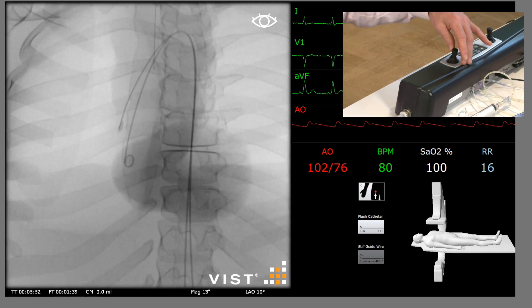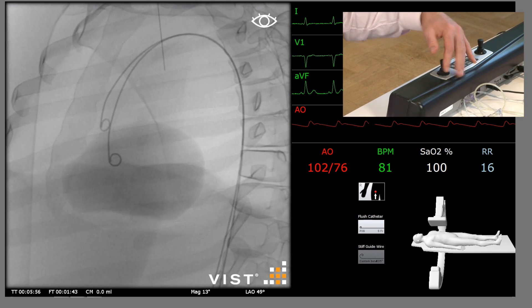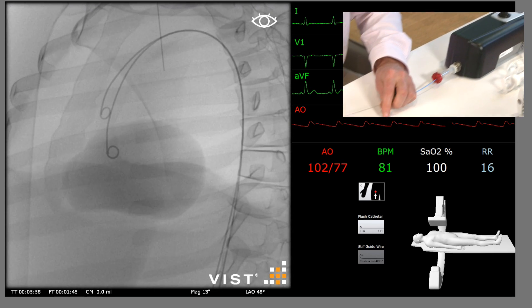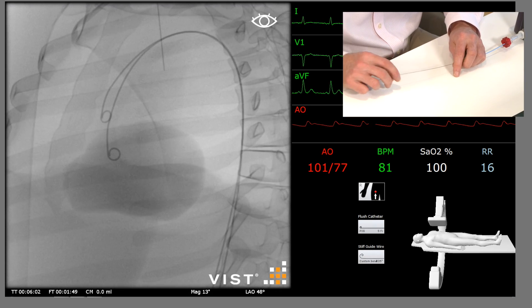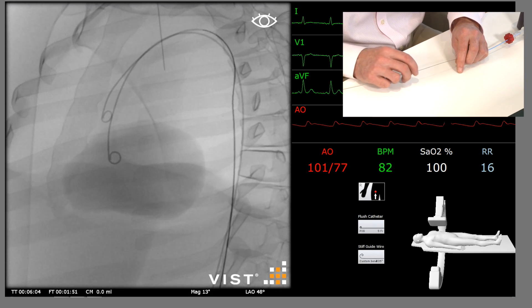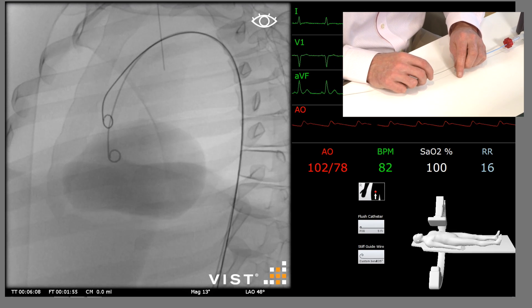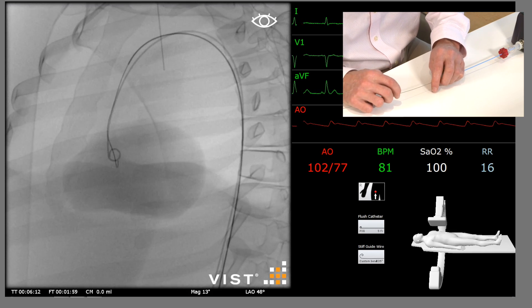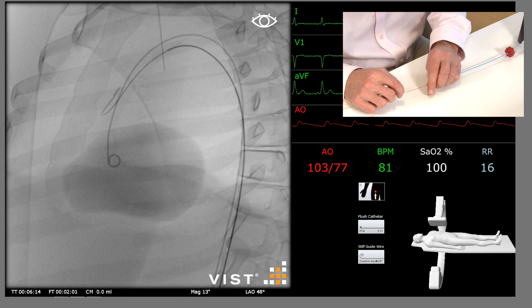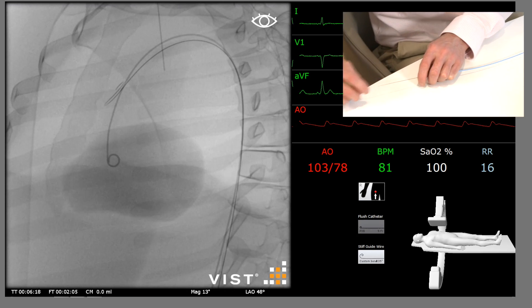To get better imaging of the arch, we're going to come into a left anterior oblique — this will open the arch up. These wires should only ever be advanced through a catheter. Take the catheter to where you want the tip of the wire, and then advance the stiff guide wire through it. You can see the pre-curved nature. Try and keep it away from the aortic valve. And then remove your catheter.